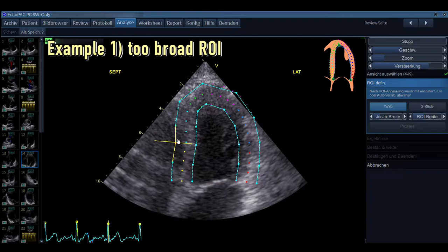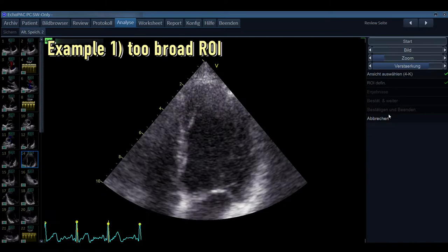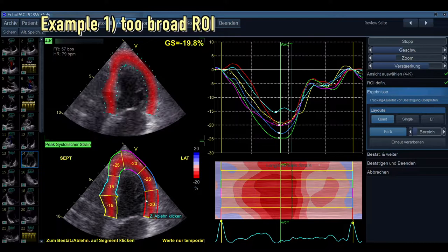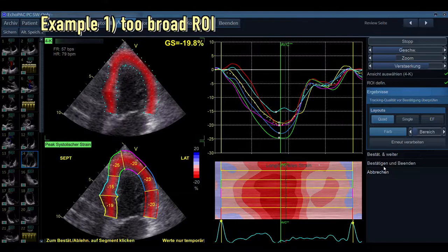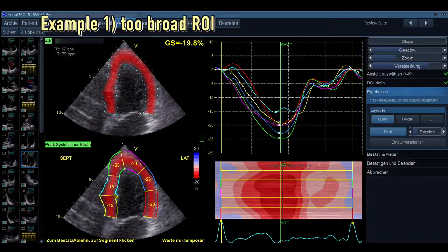So now let's do that and just exemplify how that would look like, how the tracing would look like. And of course, the tracing on the outer parts is different compared to the inner parts. So we are not in the myocardium anymore, but we are also tracing the surrounding tissues, which explains a lower value. In this case, we do not want to do that. Even though the curves are quite nice, we know from the B-mode image that this cannot be a good view.